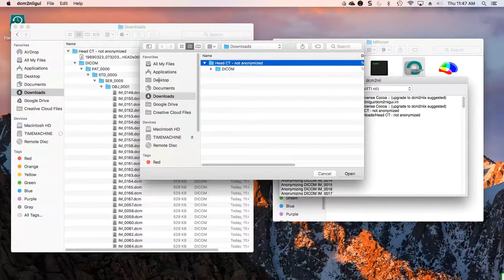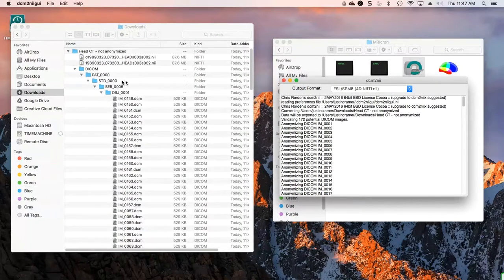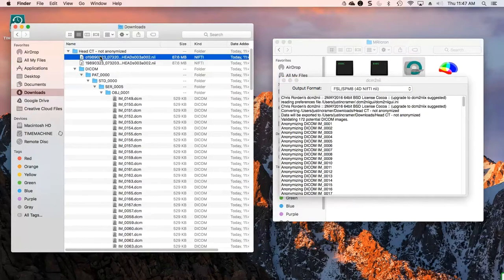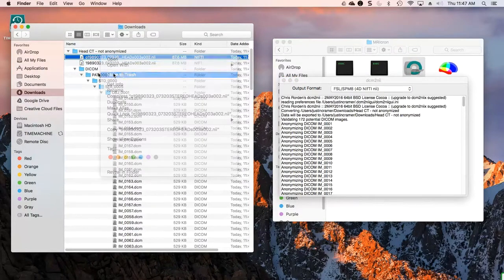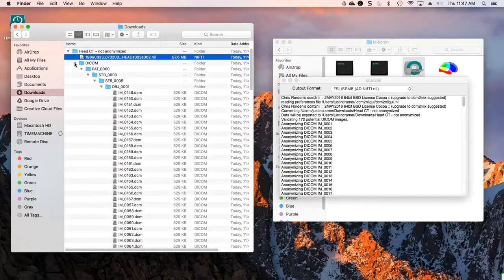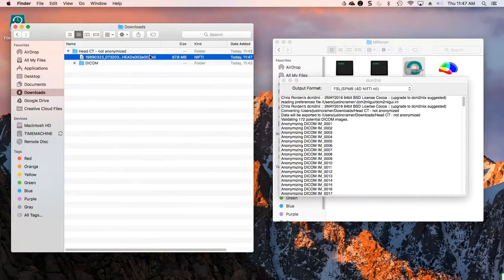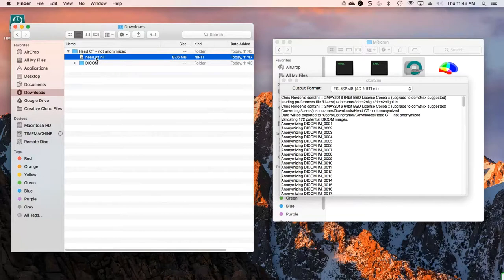I'll click Open and it'll work for just a couple of seconds, and you can see that it's finished. I'm going to delete this extra file here and collapse the DICOM tree. You see you have about an 88 megabyte file that we're just going to call headct.nii. So now you have an anonymized version of the DICOM information that is very easy to distribute.